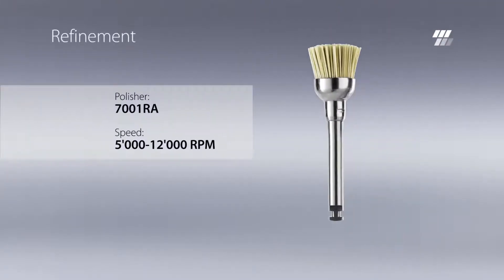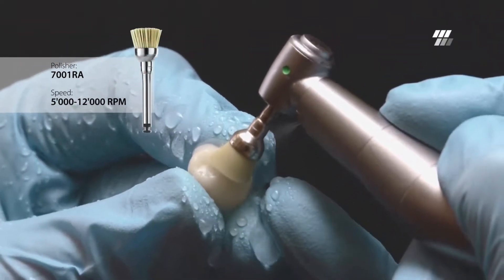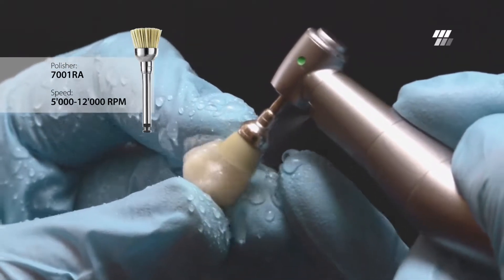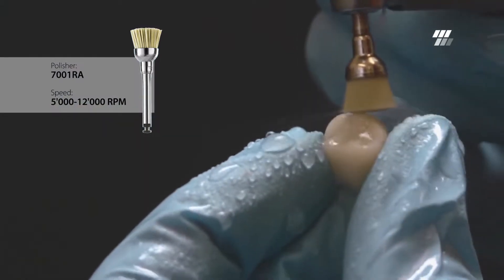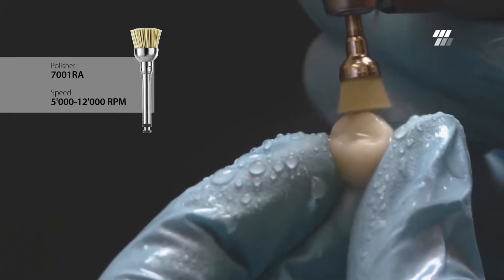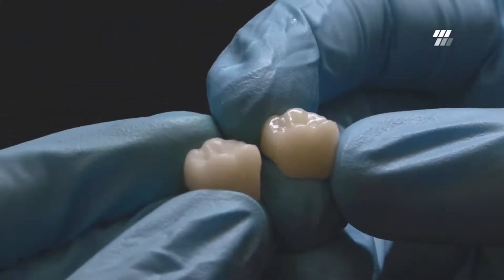For final refinement and a tooth-like enamel gloss, it is recommended to use a Diatek brush. The thin, smooth bristles are coated with fine grit silicon carbide polishing powder. This allows polishing without paste. It is particularly important for this step to exert minimal, constant pressure. The result is a natural looking surface with superior gloss.